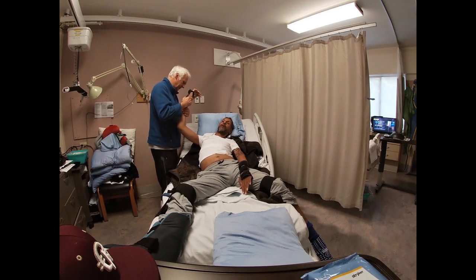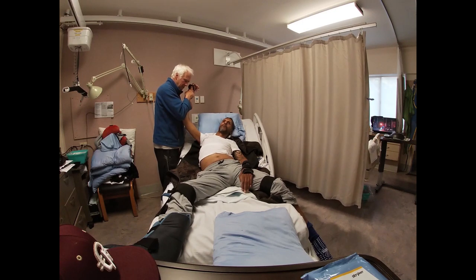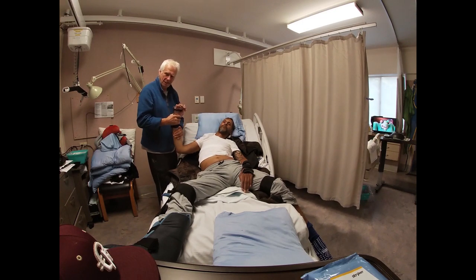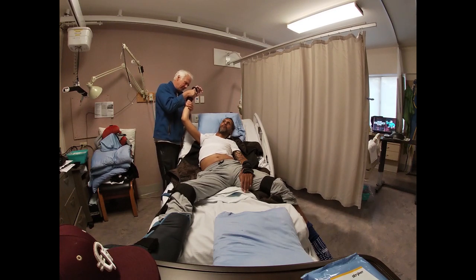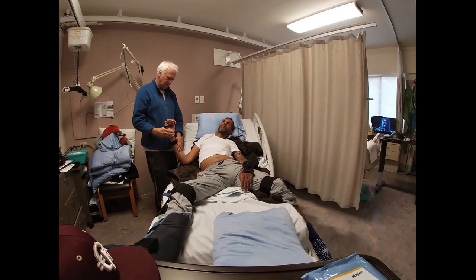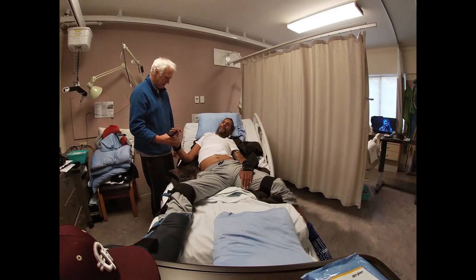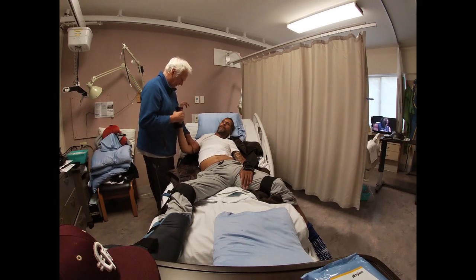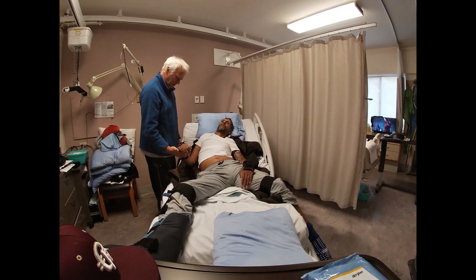Where's the pain? No pain. Just stretching my spasm in here. Okay. A little higher, a little higher. Down. Okay. So hand to the belly. That's not that strong yet, eh? Okay, push the hand down. Straighten it out to the floor.